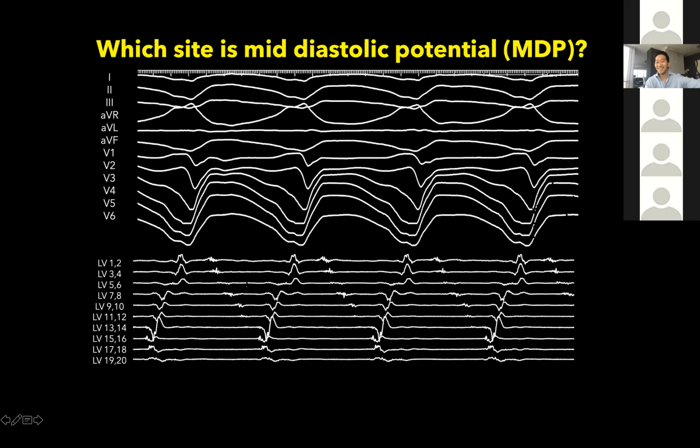Yeah, I would agree. That's reasonable. Maybe 7, mid-diastolic. 8 looks mid-diastolic. Perfect. So that's exactly what I was hoping you guys would say. Because mid-diastolic by the Stevenson idea, which is mathematical, it's 50% of the TCL, is as follows.